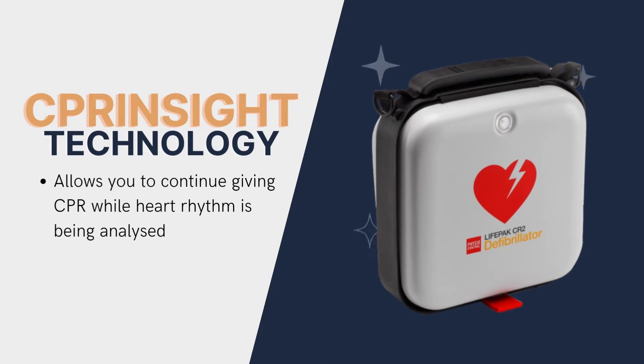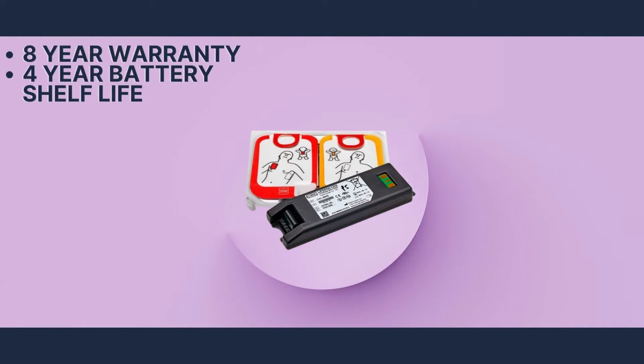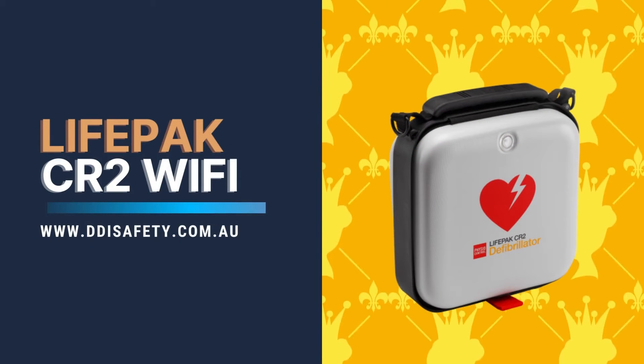With an awesome 8-year warranty and a 4-year battery and pad shelf life, this is an investment that will last. Get the CR2 Wi-Fi models at an amazing price today at ddisafety.com.au.